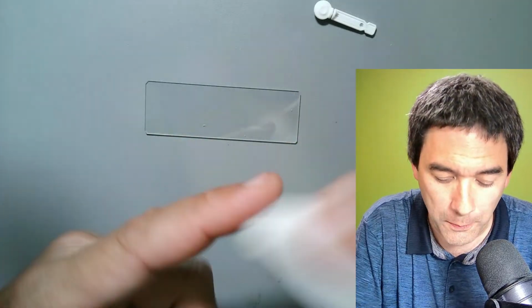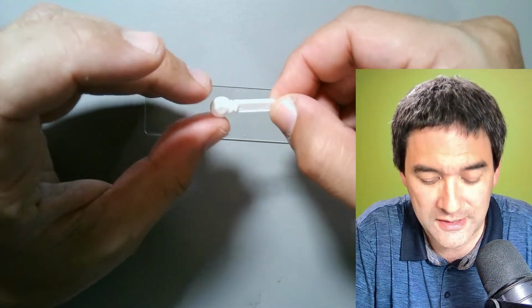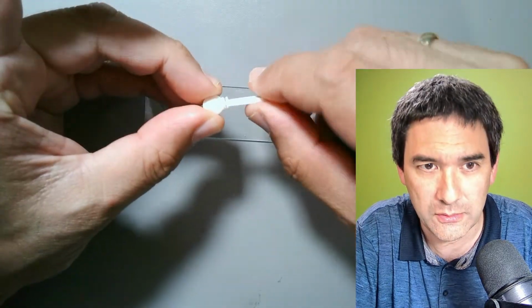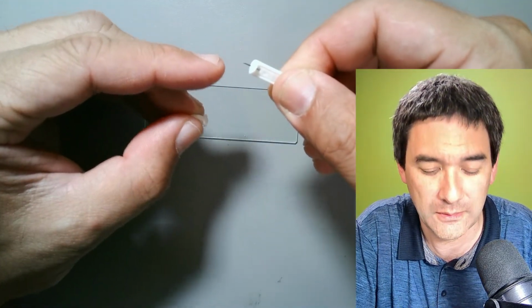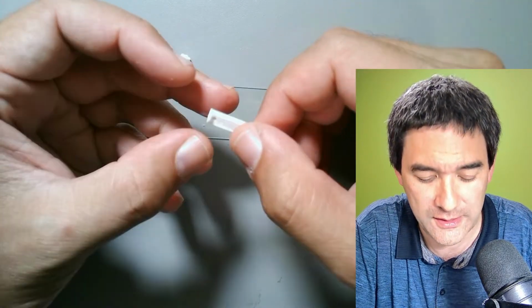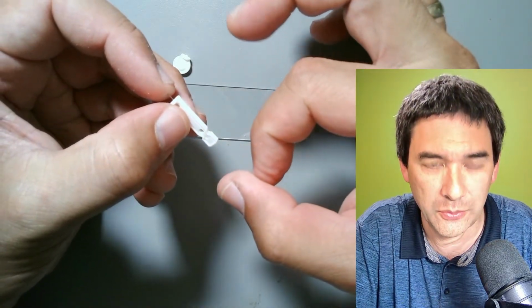Soap, by the way, does something similar. I think that's definitely enough. And now this is where the tough part starts. I'm going to show this to you now. Look, there is a little cap on here that you have to remove because it is sterile. So you remove this, and this is how it looks. There is a sharp needle here. What I have to do is prick myself, and this is really psychologically difficult to do. So I will try a different way.